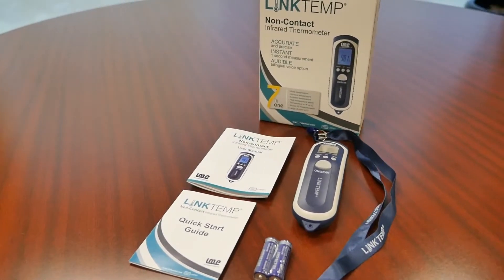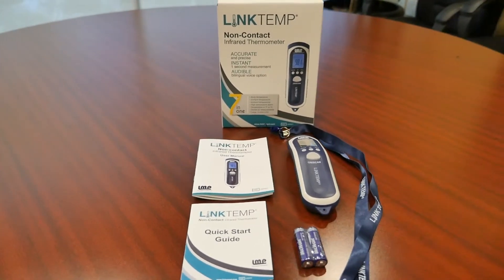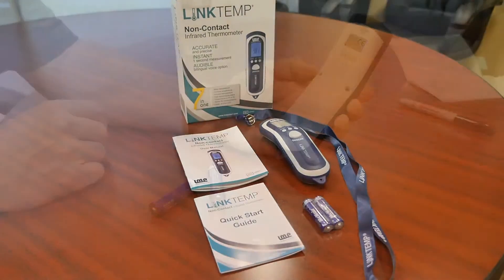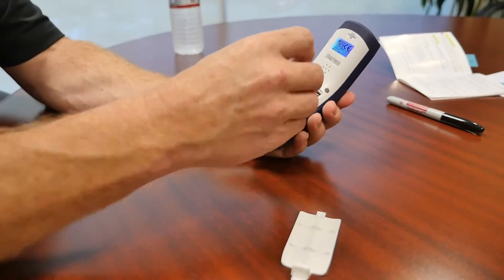two AA alkaline batteries, one lanyard, one quick reference guide, and one LinkTemp Non-Contact Infrared Thermometer.